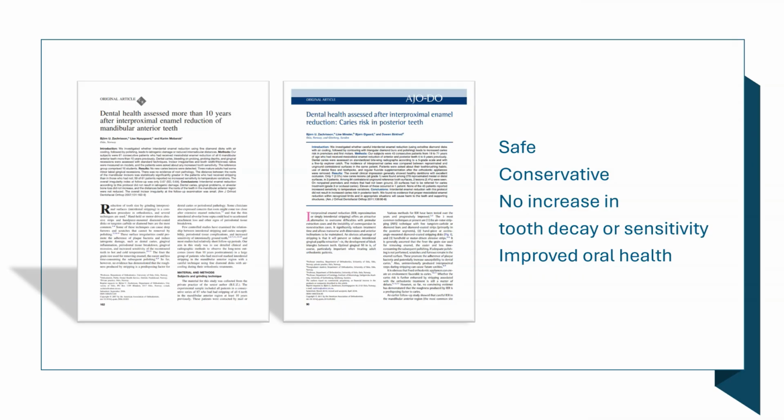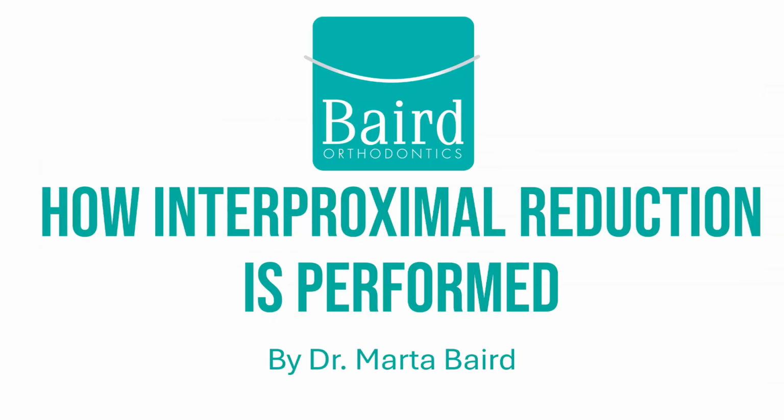There have been many studies over the years as orthodontists have been concerned about the safety of interproximal reduction. Interproximal reduction has been found to be safe, a conservative way of gaining space with no increase in tooth decay or sensitivity, while at the same time it improves oral health by increasing the ability to floss properly in areas where teeth were overlapped without creating those dark gingival voids where food might get trapped.